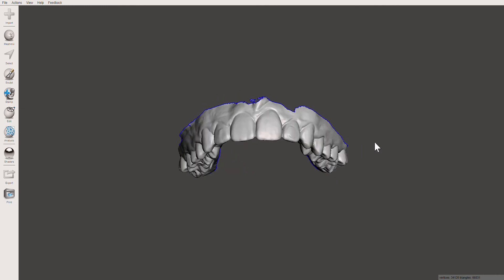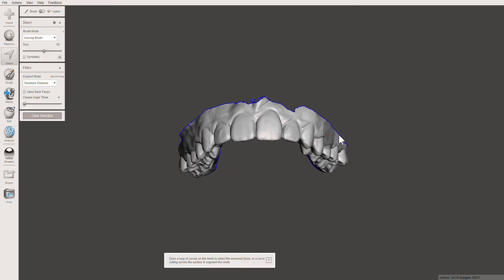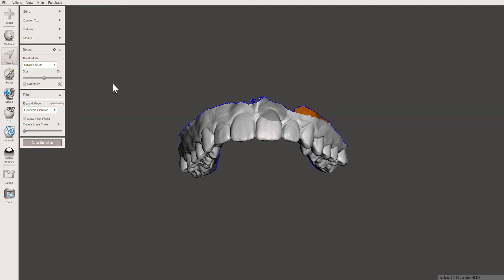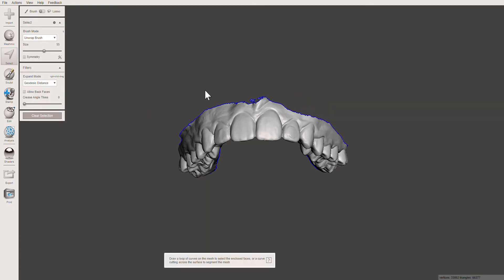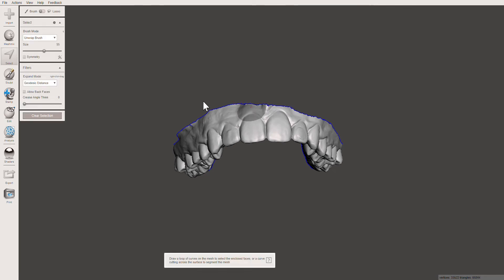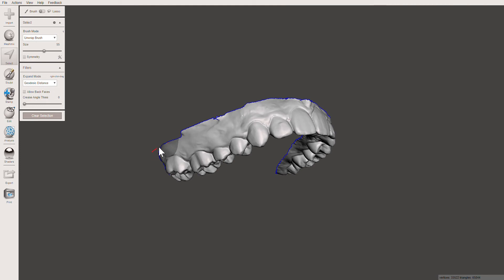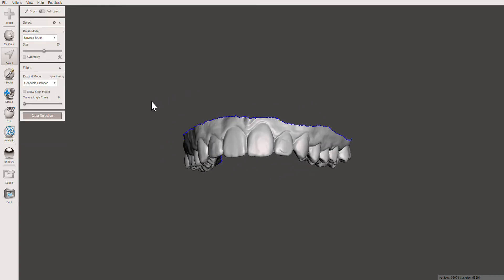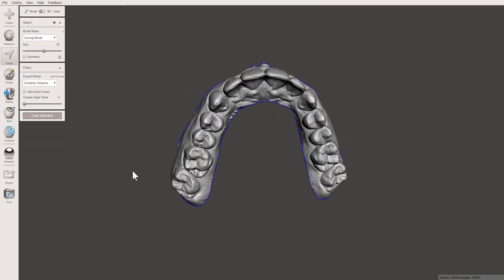Now I'm going to clean up the top of this area. Going back into Select, what we're doing here is trimming these edges and making it nice and clean, so when we extrude the base it'll be a smooth base.